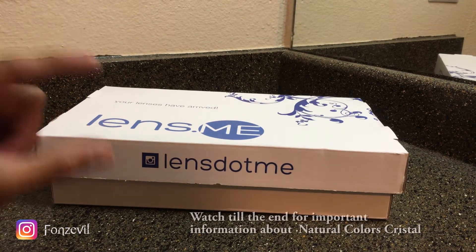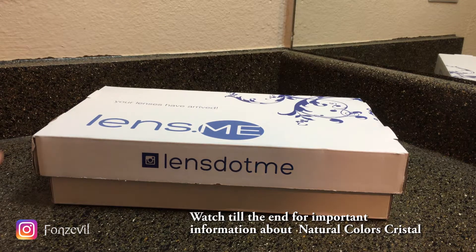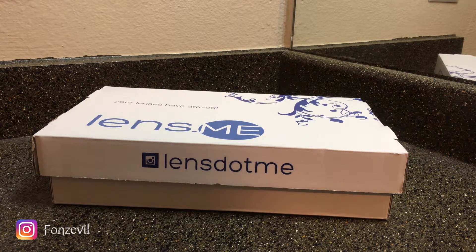You guys will notice that you get these little glass flasks, but a lot of you guys have been having issues trying to open it. Some of you guys cut yourselves and that's not safe, so I'm going to be showing you guys how to properly open it — at least my way — the way I avoid getting hurt.